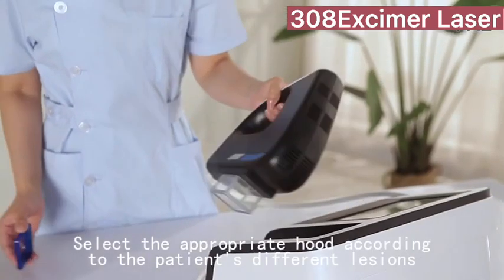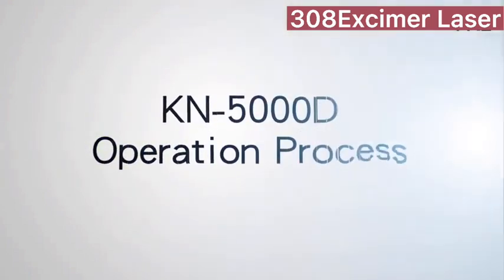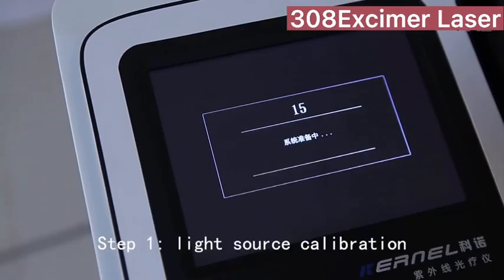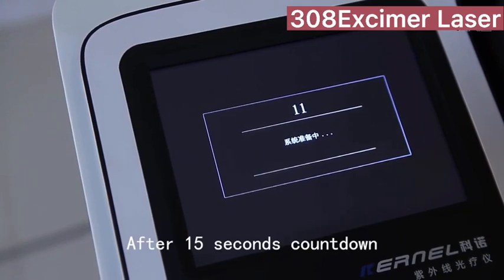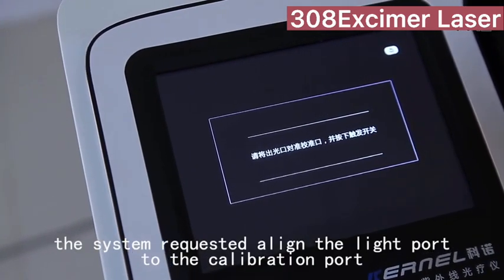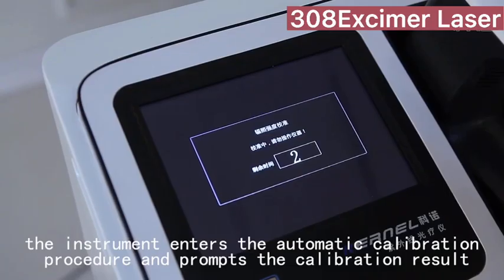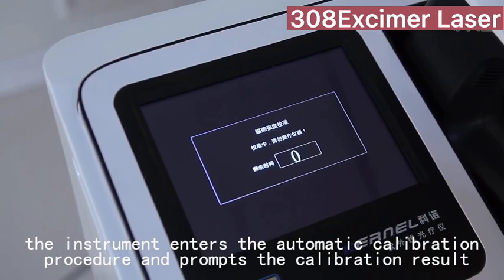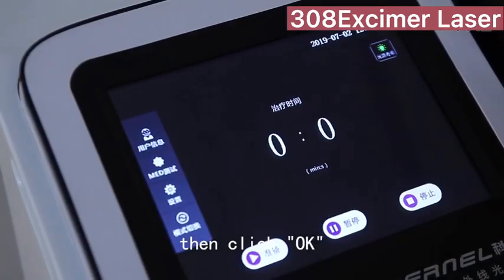Select the appropriate hood according to the patient's different lesion. KN5000D operation process: Light source calibration. After a 15-second countdown, the system requests you to align the light port to the calibration port. Press the button on the handle — the instrument enters the automatic calibration procedure and prompts the calibration result. Then click OK.